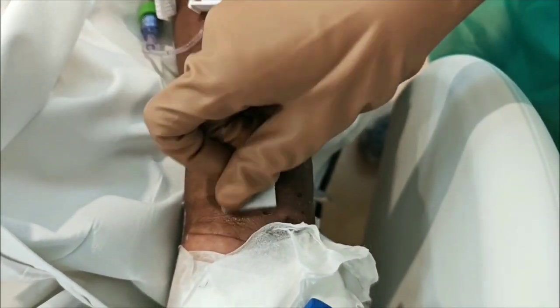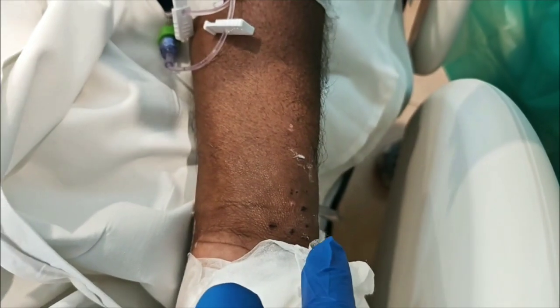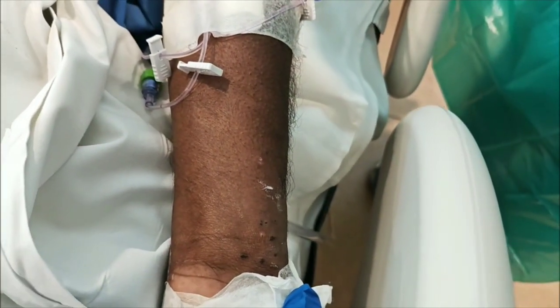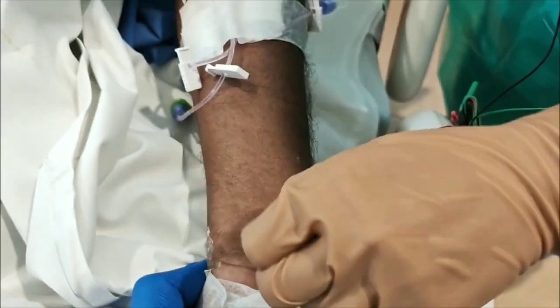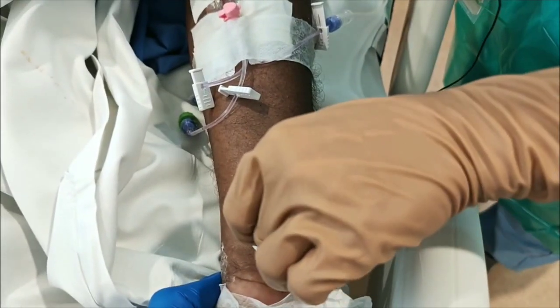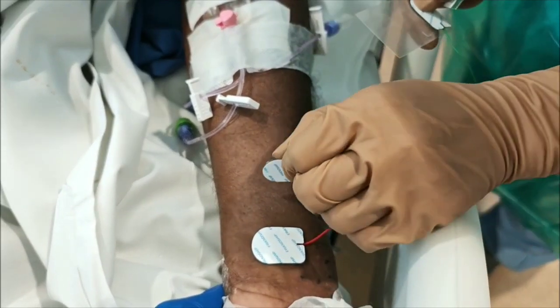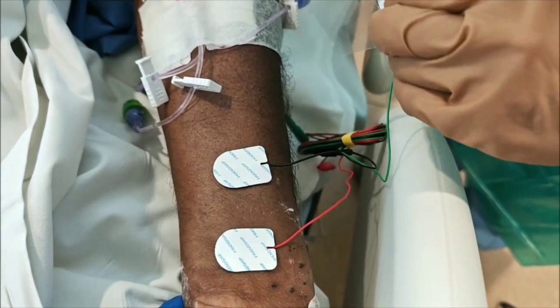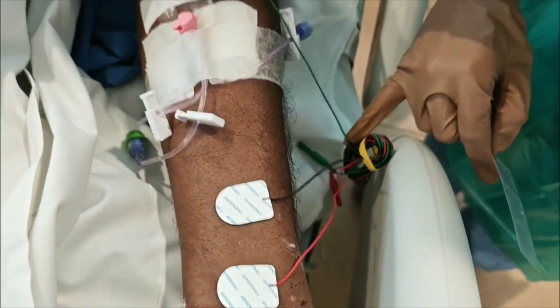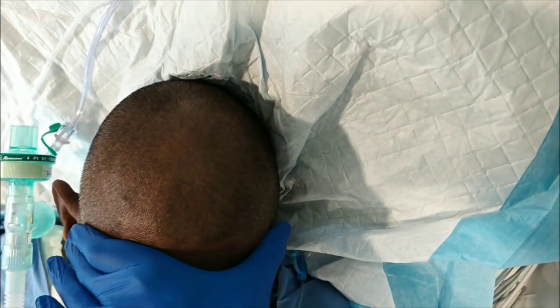I'll first clean the skin using an alcohol swab so we don't encounter impedance interference — ideally the impedance should be less than five kilo-ohms. Then I'll place the electrodes: I'm palpating for the tendon and placing the active on the tendon, followed by the reference, which should ideally be placed two to three centimeters away. The ground can be placed a little further, between the stimulation and recording sites.